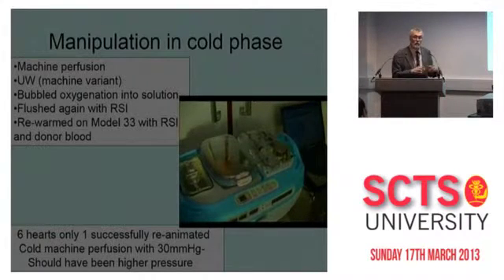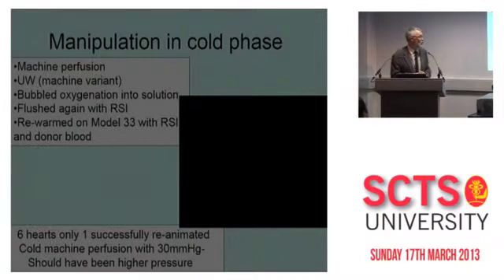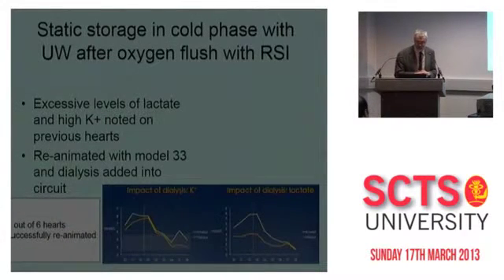Now, by doing that with the DCD, we only found one of the hearts we managed to reanimate, so it wasn't very good. In retrospect, the machine perfusion we used wasn't good enough because the pump flow wasn't fast enough, because it has to be quite high to actually close the aortic valve, and this one wasn't.